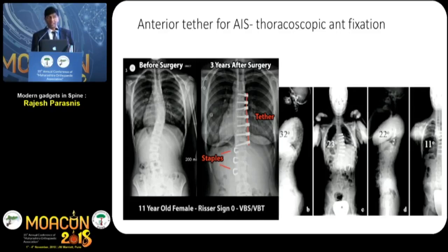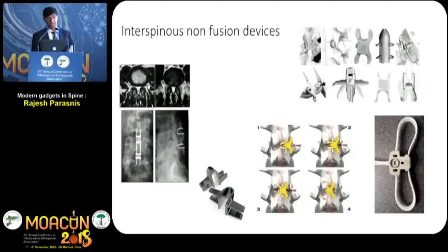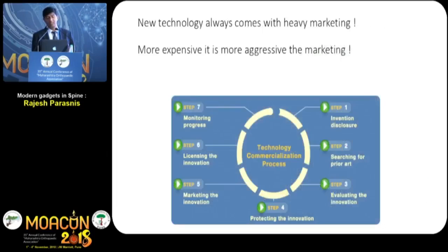So these are technologies which are making a comeback with a little fine-tuning or improvement, which are here to stay. And then there are technologies where it is very, very confusing. If you see the literature, interspinous implants, many of the senior surgeons denounce, but there are also a lot of minimally invasive surgeons or even standard surgeons like me and Abhay, we are using certain kinds of implants for selective cases which have good results, right? So literature cannot be the gold standard for everything. You have to also see which journals, what kind of indications and where the data is coming from. So these are technologies which are still present, used sporadically.